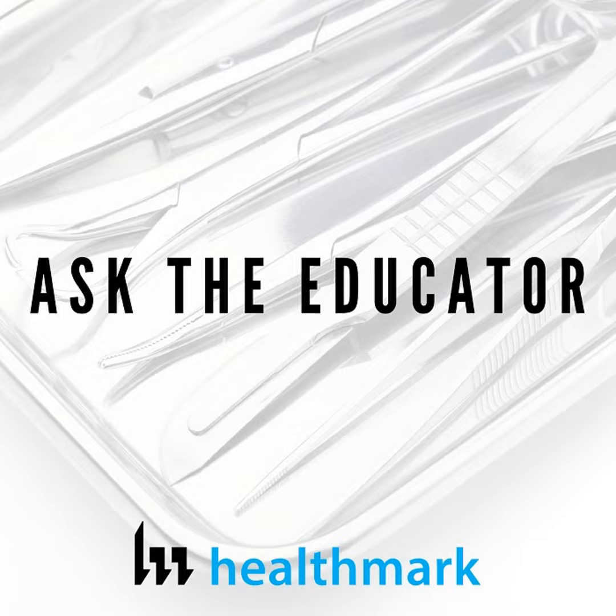It is. And I think that's the biggest issue, because I was going to ask you what we could do going forward to fix this. But I think in sterile processing, there's a real lack of understanding about what a shaver is and what it's used for. When I first started and heard the term shaver, I assumed it was shaving hair off of the surgical site. That's not what arthroscopic shavers are doing. They're in there shaving bone. They're in there getting really gritty and nasty stuff inside of them.